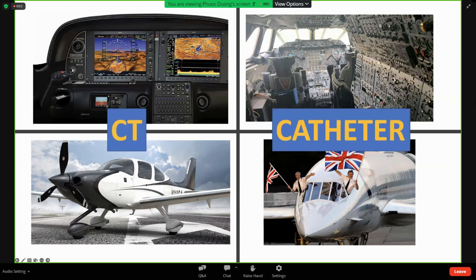And this is what you're going to see. So I'm using this analogy just to illustrate that the use of CT can actually make the procedure a lot more user-friendly, and also help the rest of the team really understand the anatomy and management of this.